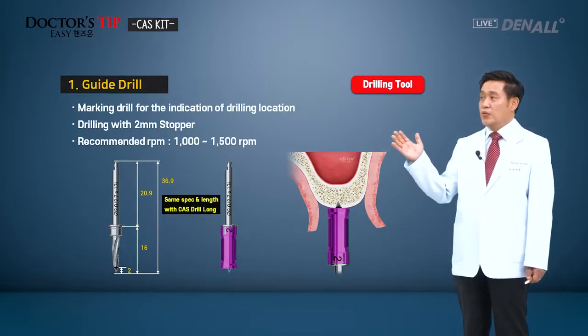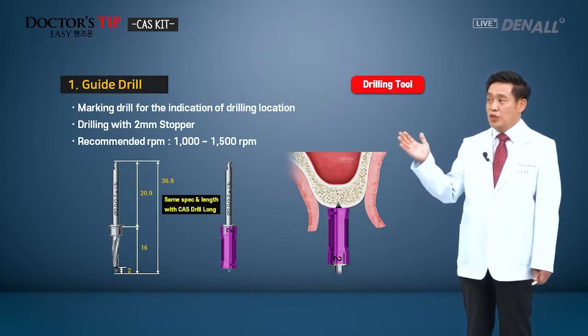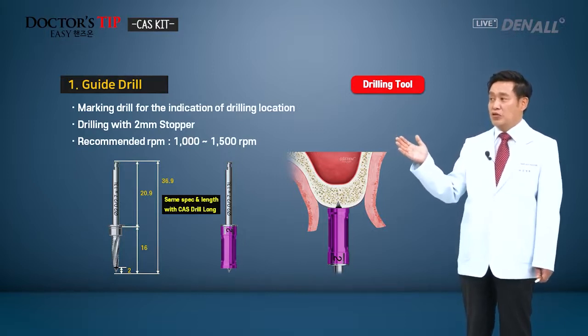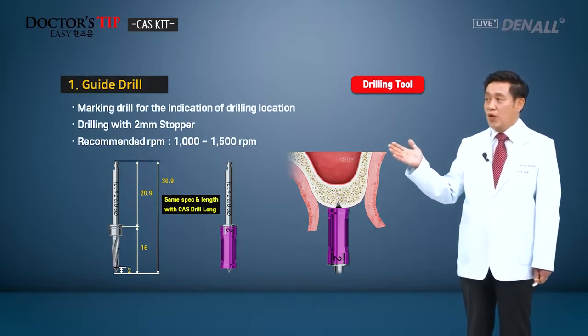First, the guided drill. Basically, it is to mark the drilling location. A 2 millimeter stopper is recommended to do the marking. The recommended RPM is 1000 to 1500 RPM. The length is the same as the CAS drill.